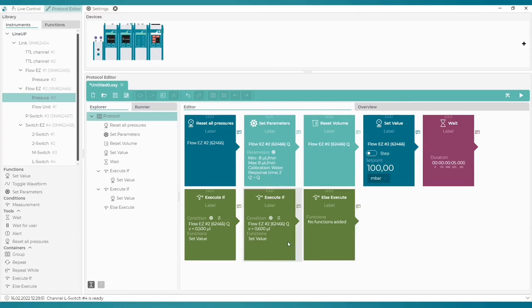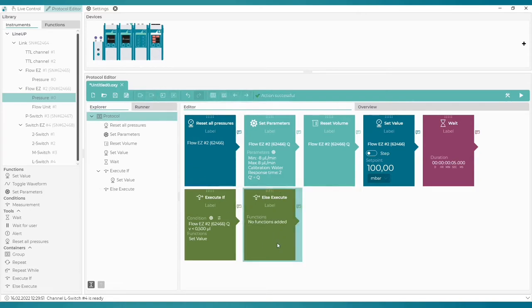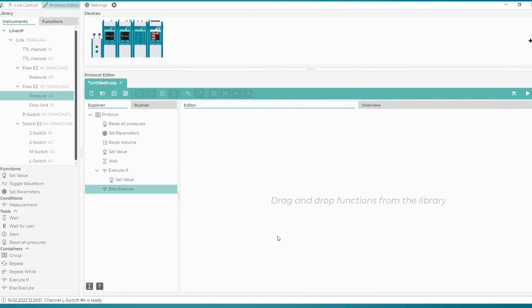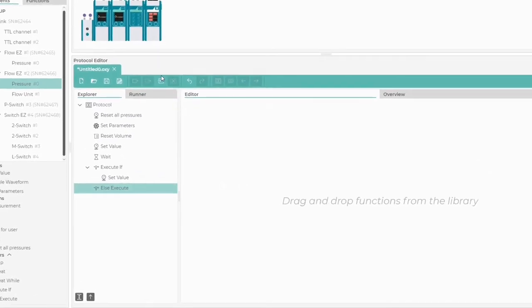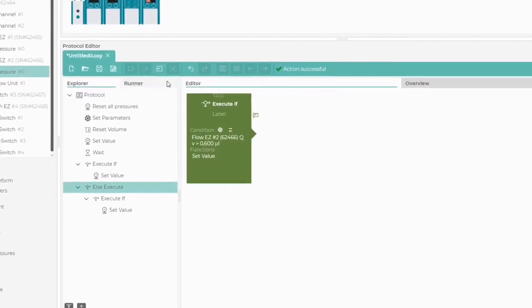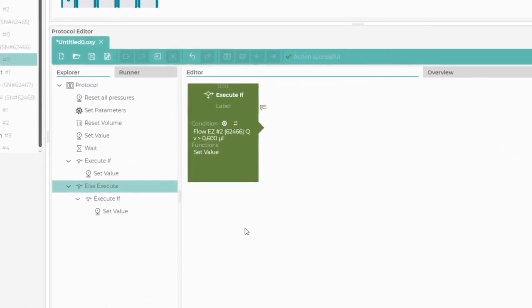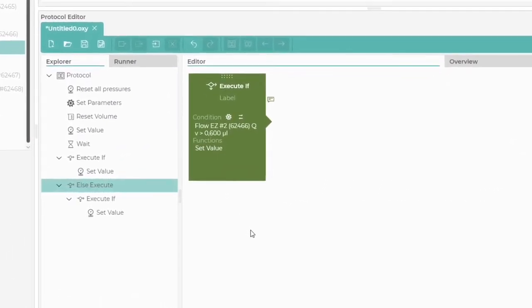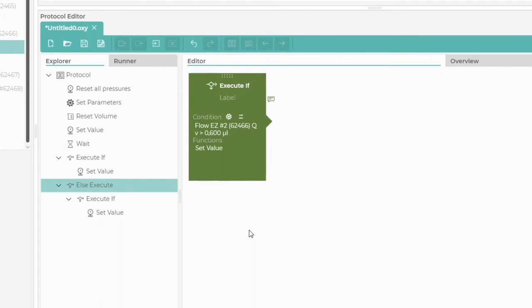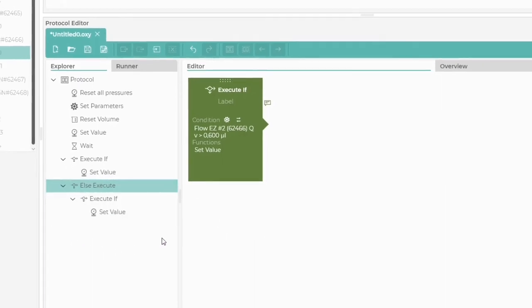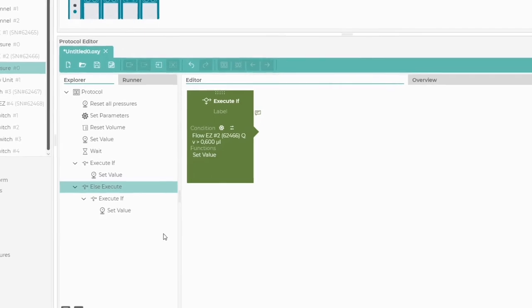Let's cut and paste our second Execute If block into it. As we can see in the Explorer tab, we now have a container inside the container.